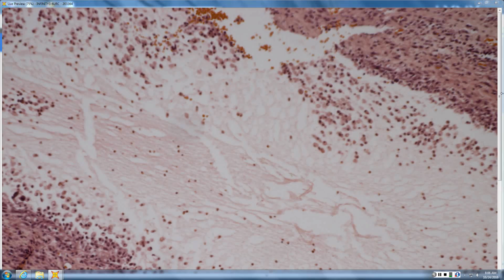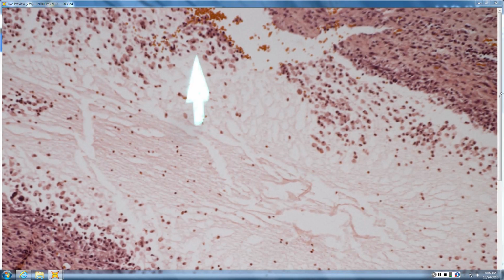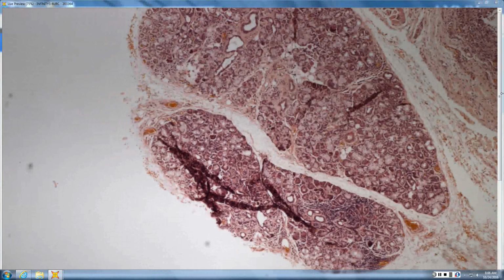So this would be a more typical look for a mucocele. Lots of mucophage, palisaded granuloma, and pools of mucin in the center. And if you see the minor salivary gland sitting there, that's a big hint. Similar appearance on an eyelid would be chalazion. Chalazion, chalazion, I think you can say it both ways.